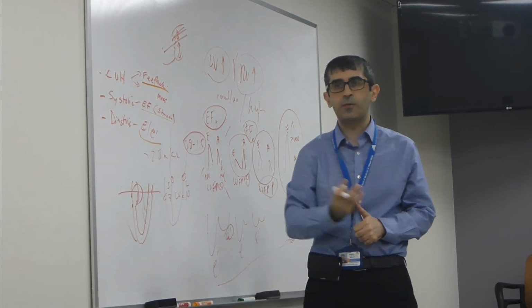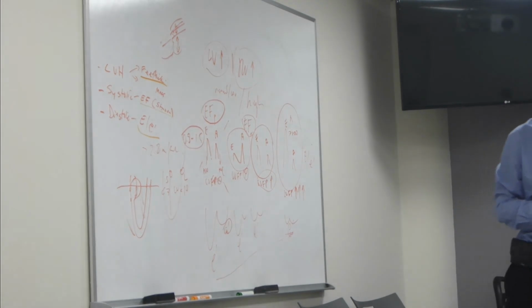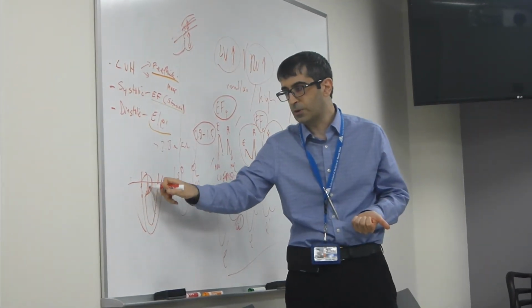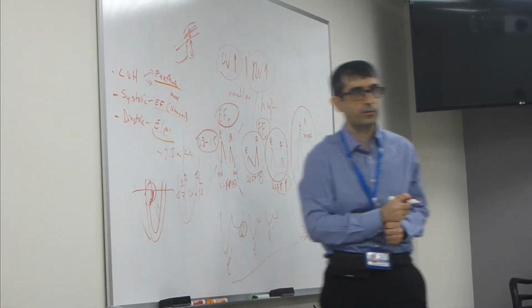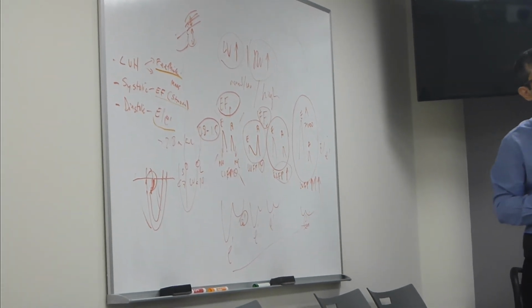I guess Roberto's not going to have a bulge, but if you had somebody with a septal bulge, like an older person, you usually try to avoid the bulge portion and measure a thinner, more normal portion of the septum. More towards the apex, you're saying? Yes, more towards the apex, away from the bulge.